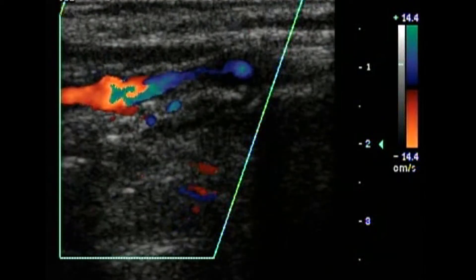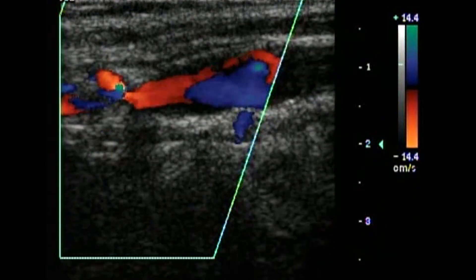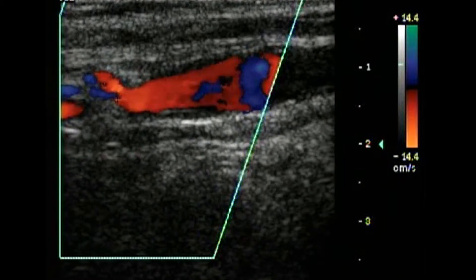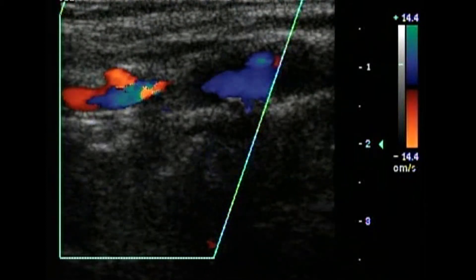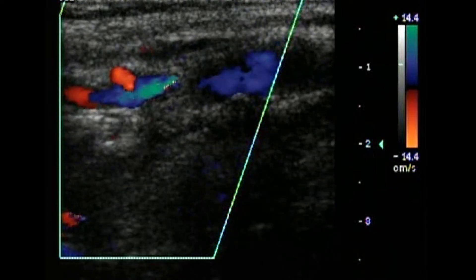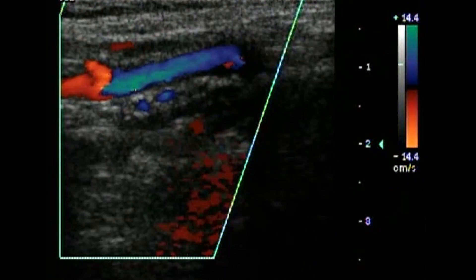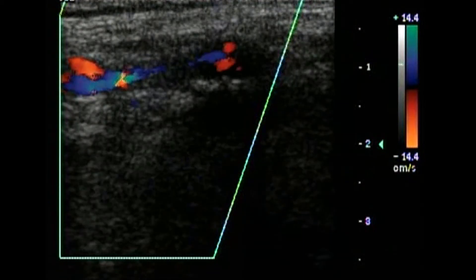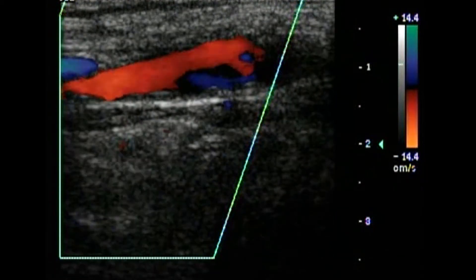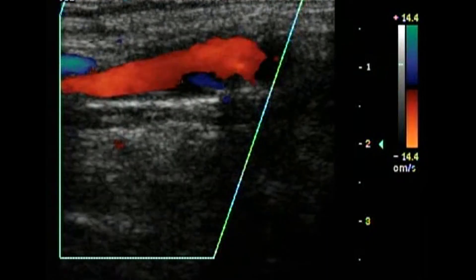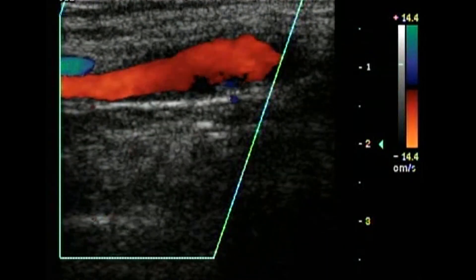Note, not only is it retrograde flow — note the retrograde ECA branch in red, flow away from the transducer, flowing into the external carotid artery, and then retrograde flow towards the transducer being displayed in blue, feeding the internal carotid artery.